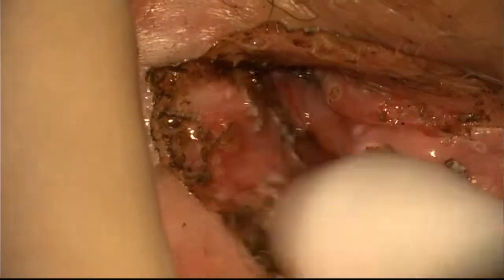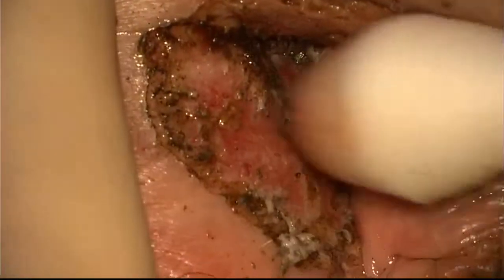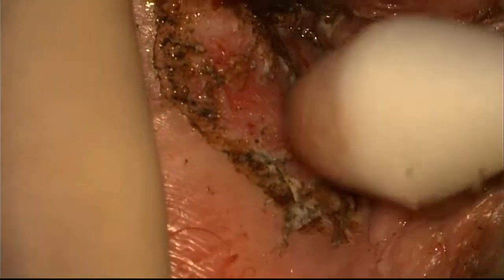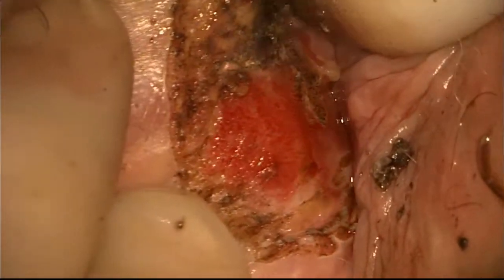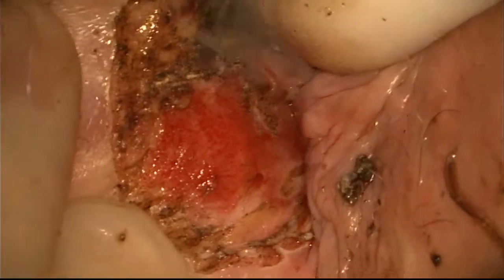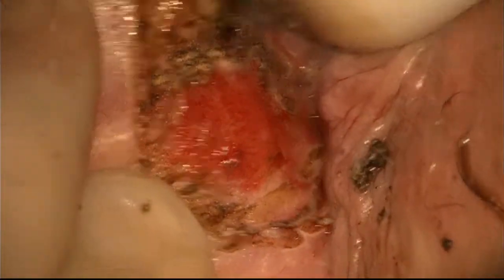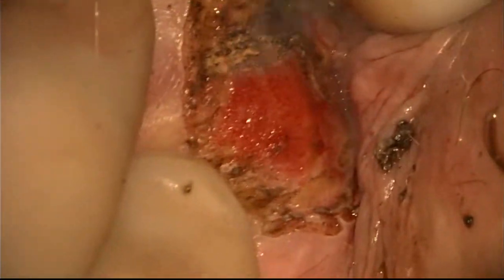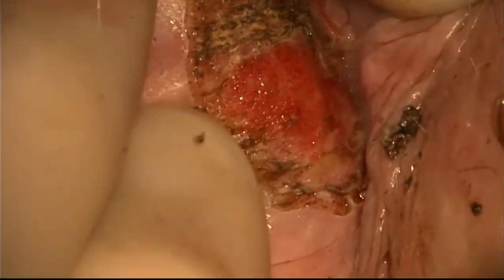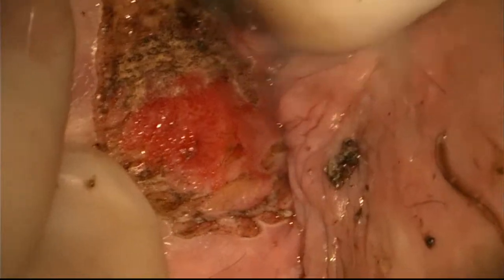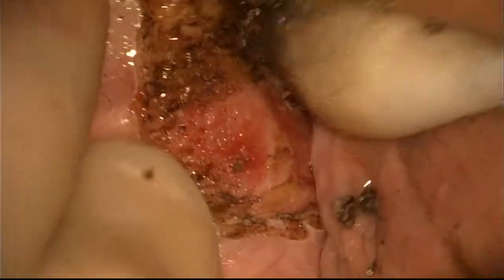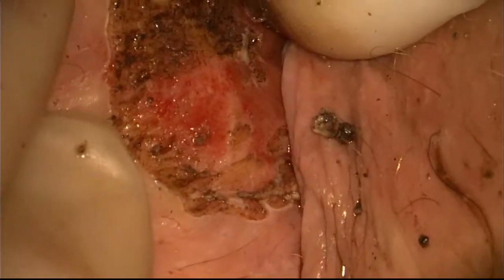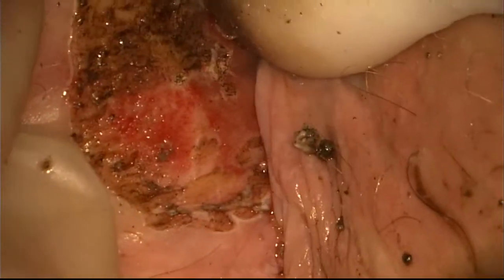After using the laser on this first pass down to the papillary dermis, we peel away the char and we can see the papillary buds of the underlying papillary skin. Now pass the laser a second time to get to the second surgical plane. This will be the chamois cloth appearance of the reticular dermis.